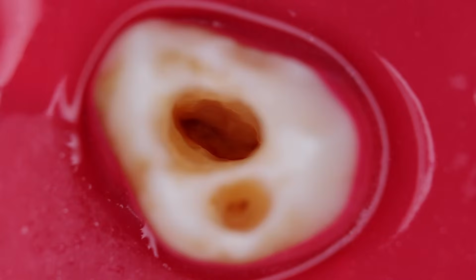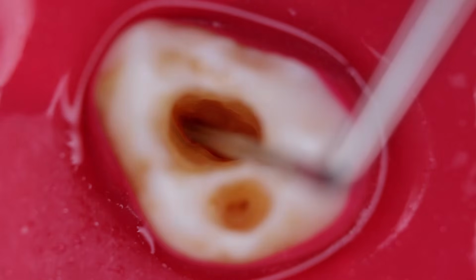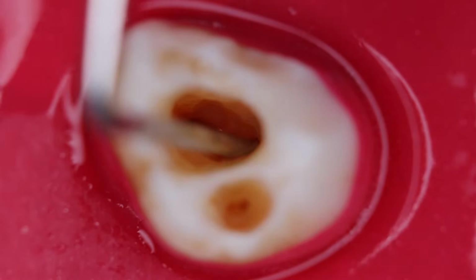Hope now you can look for the orifices easily. This is the mesiobuccal canal orifice, and then the distobuccal canal orifice and the palatal canal orifice.